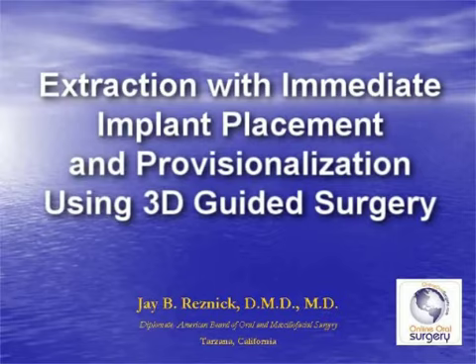So the next big revolution in implant dentistry was the ability to take this data on the computer and be able to translate that into a surgical guide that could be used for very accurately placing the implants in the precise spots, positions, and angulations where we had planned on the computer. And thus was born 3D guided surgery.